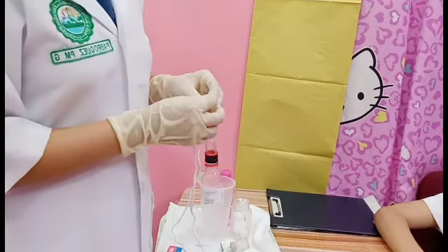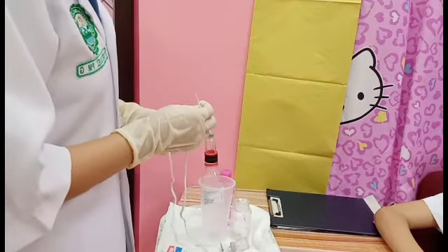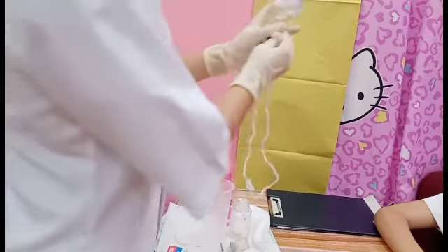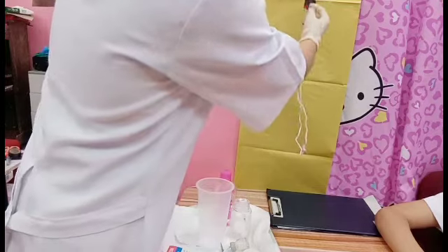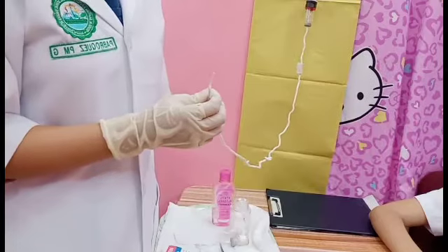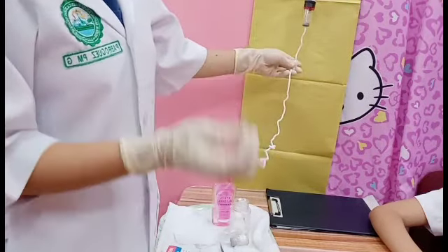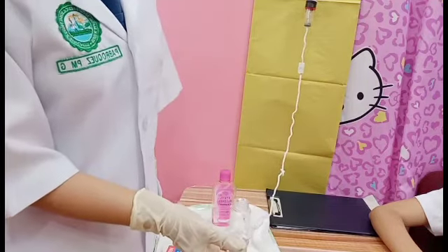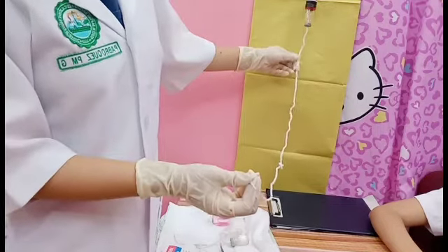Hang IV container on pole and squeeze drip chamber to fill at least halfway. Next is to remove the cap at the end of the tubing. Release clamp and allow fluid to move through tubing until air bubbles have disappeared. Close clamp and recap tubing, maintaining sterility of setup.